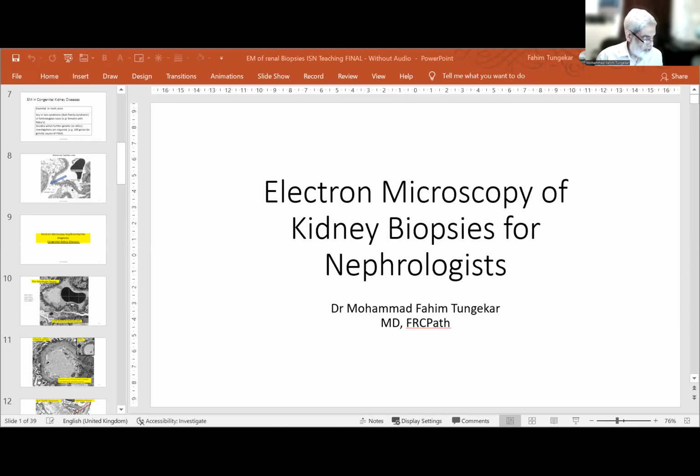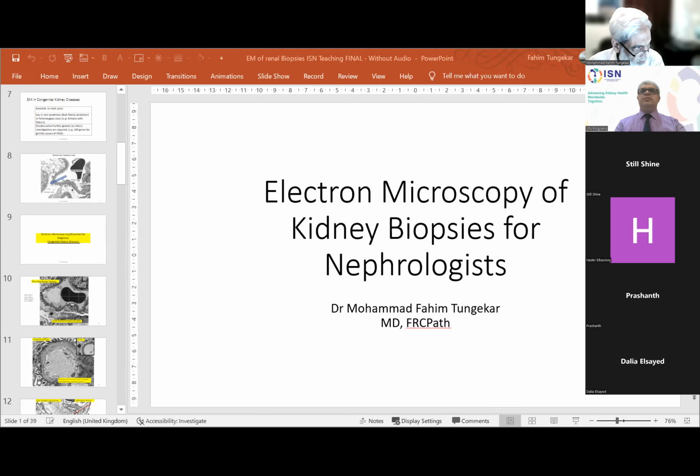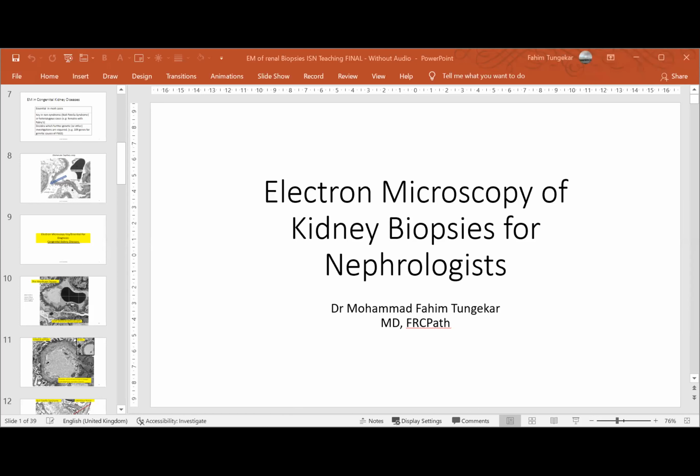A brief disclosure: most of the material in this presentation is from my forthcoming ebook, Kidney Biopsy Pathology: A Manual. Therefore, it will be subject to copyright to the publisher. Abbreviations used, because I may rush quickly in my presentation: most are well known. EM is for electron microscopy, GBM for glomerular basement membrane, IF for immunofluorescence microscopy, and LM for light microscopy.